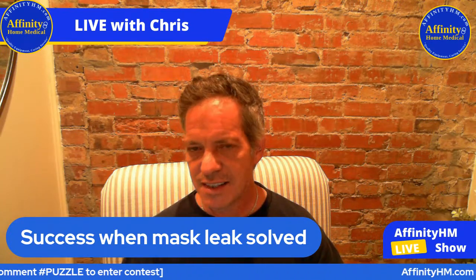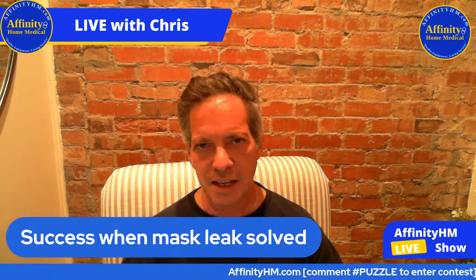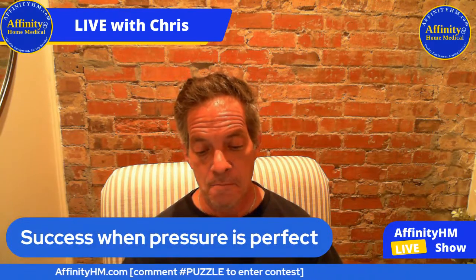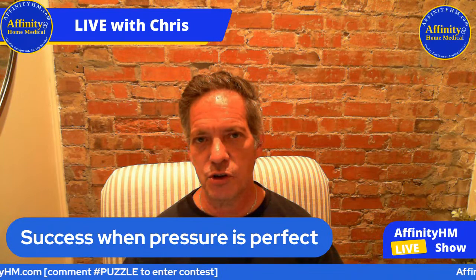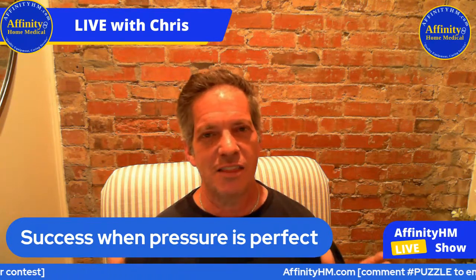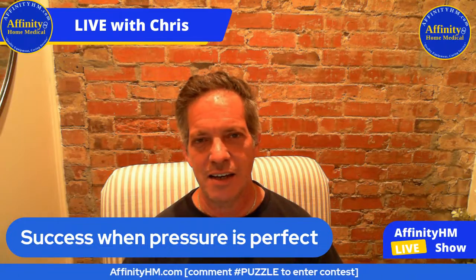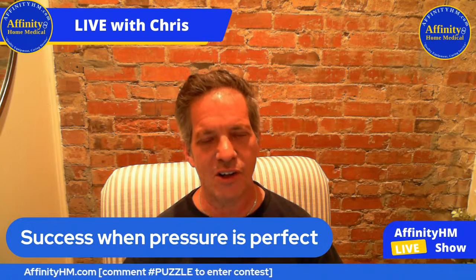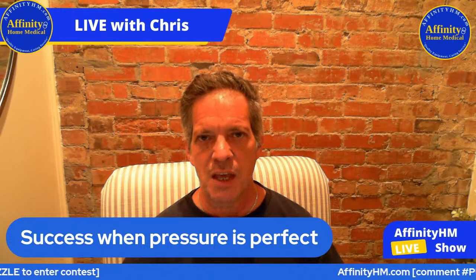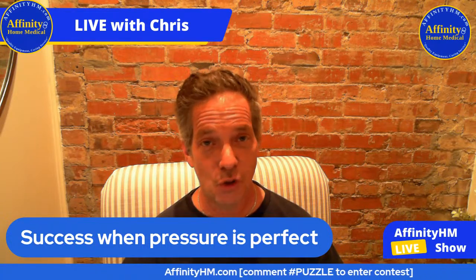All right, so celebrate your successes. Whenever you pass one of those hurdles, celebrate that and keep going. That's ultimately the key. And when you get that pressure perfect, you're going to know it. You know how you'll know it? It's not the phone app. It's not the number. Getting that 100 score is not necessarily the holy grail of pressure perfection. You'll know the pressure is right because you slept so well.